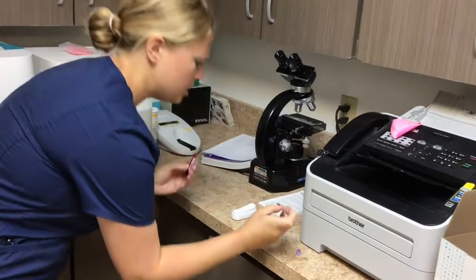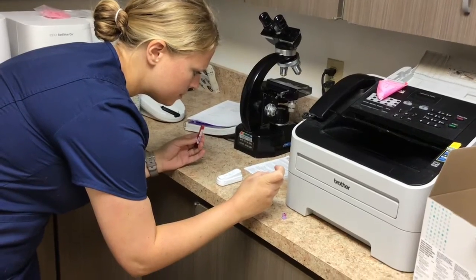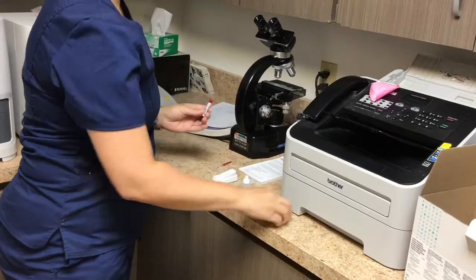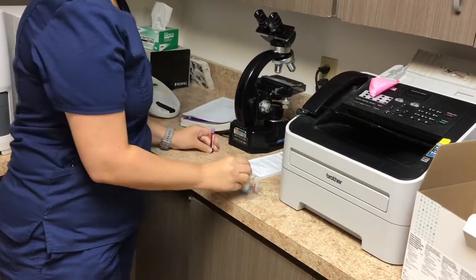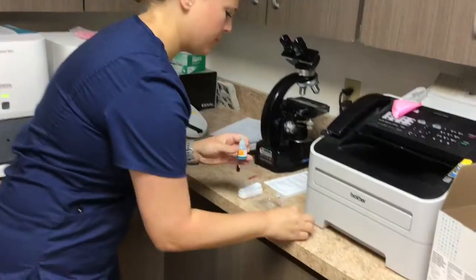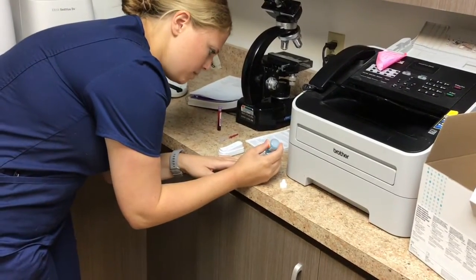I'm going to put 3 drops of blood into my sample, followed by 4 drops of my reagent.